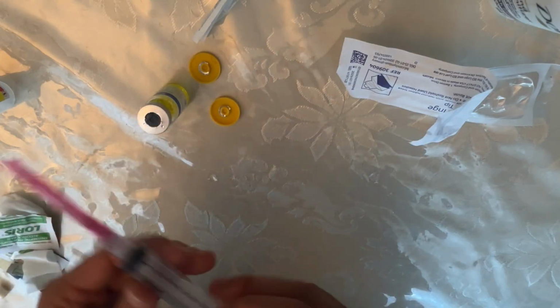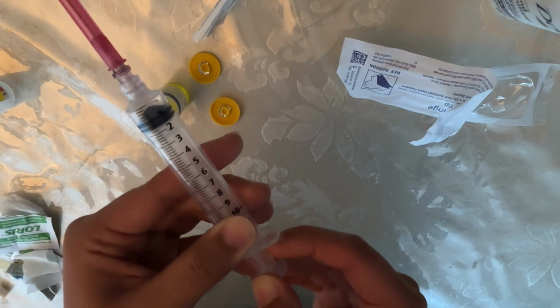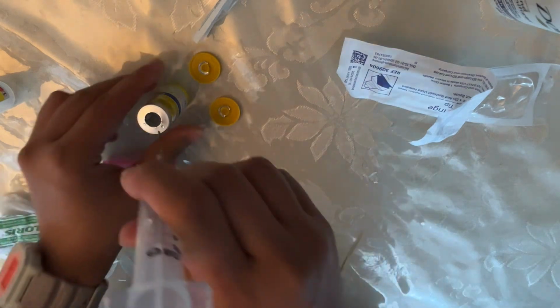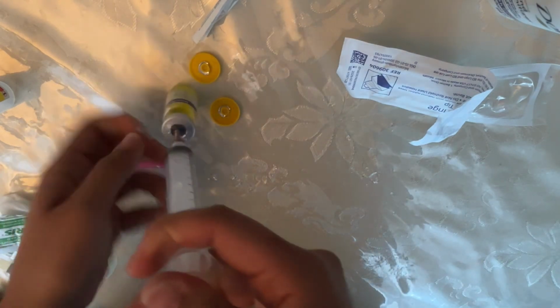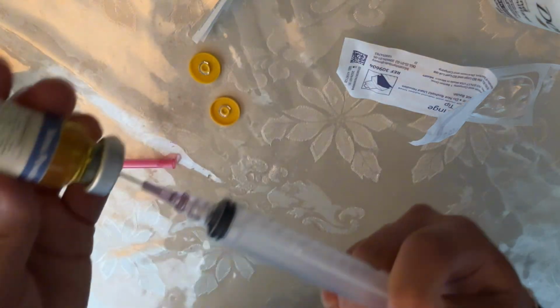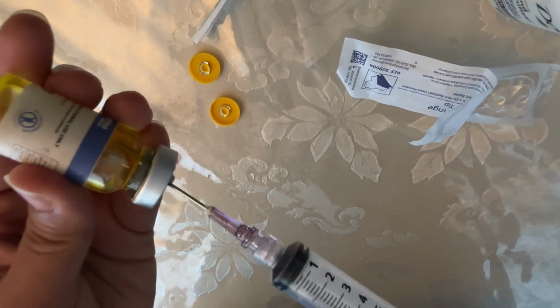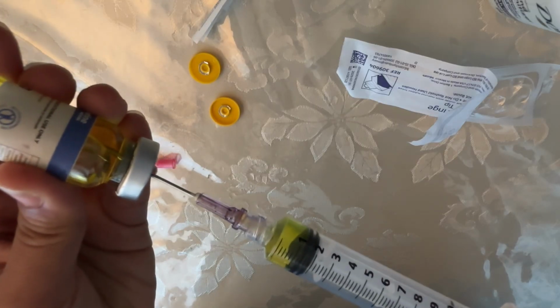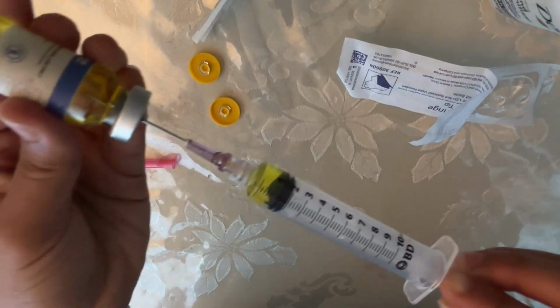So I'm just going to go ahead and do that. I'm going to inject 1 ml of air, 1 ml. Make sure that your needle is inside the medication, not in the gap. So we draw 1 ml, an extra for bubbles and for priming.